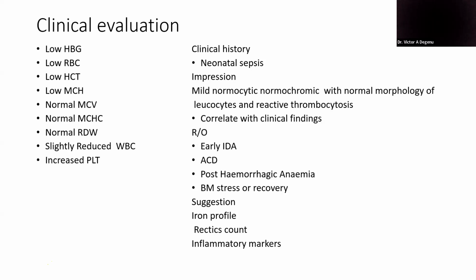I think I made a caveat that it's just an assumption that we are doing. That is for you to critically look at what the machine is presenting before you. And in so doing, we have time to look at WBC and its implications, either low, normal, or high. So when we get there, we'll look at it critically. But this one is just an assumption that we are employing to say it is slightly reduced, slightly.